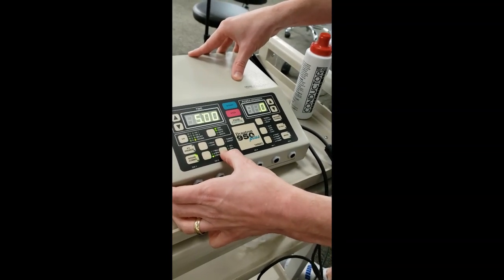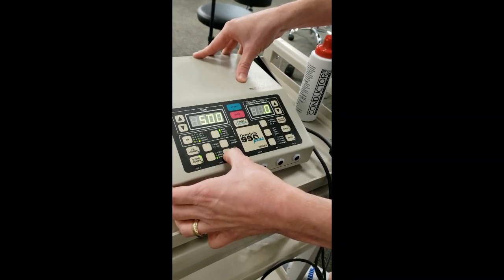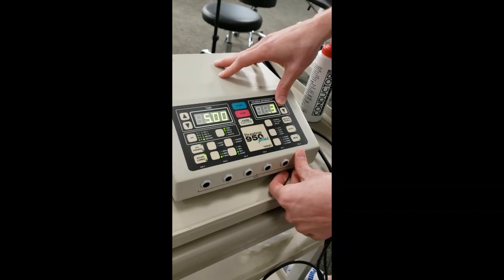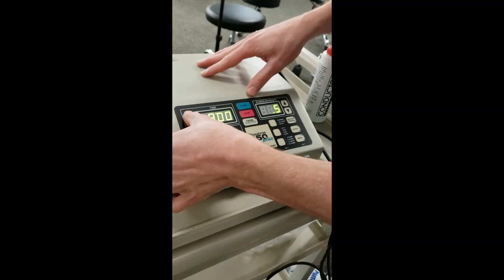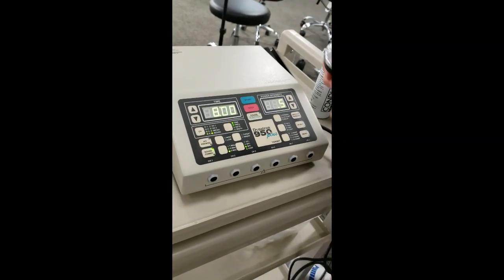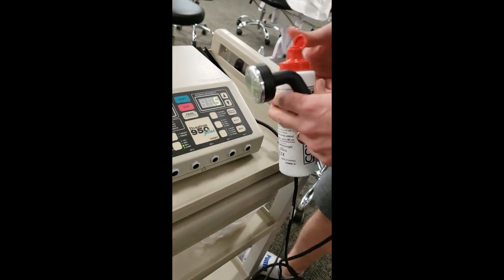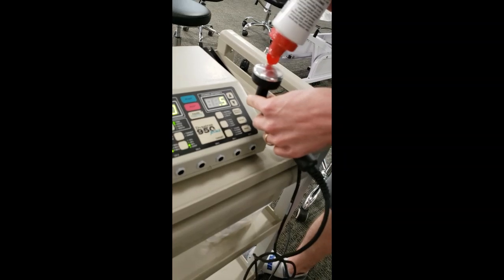And then because we want to do a non-thermal treatment, because this is an acute injury, we're not going to want a continuous cycle. We're going to want to change this to 50%. The intensity that we're going to choose is probably going to be around 0.5. And then I'm going to do the treatment for about 8 minutes. So I have everything all set up here. The next important thing is just having this in contact before I press start, as well as having the coupling medium already present there on the skin or on the head of the instrument.